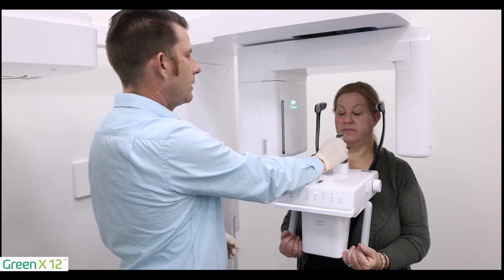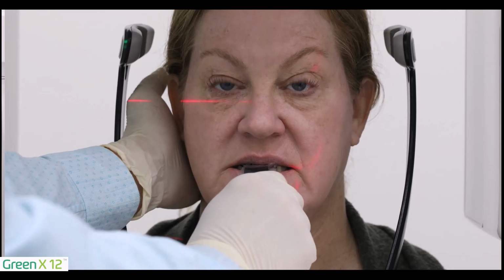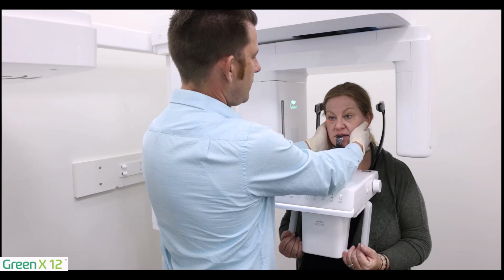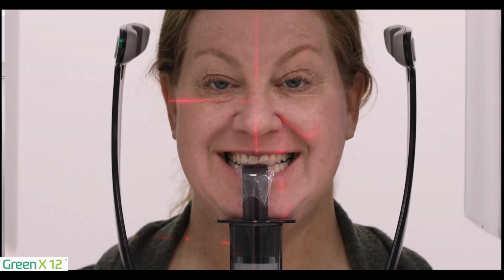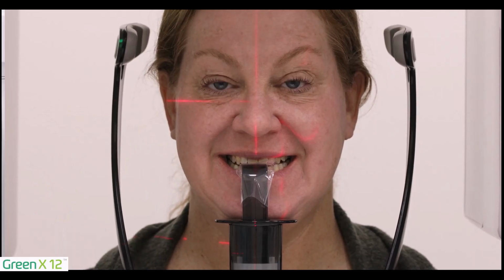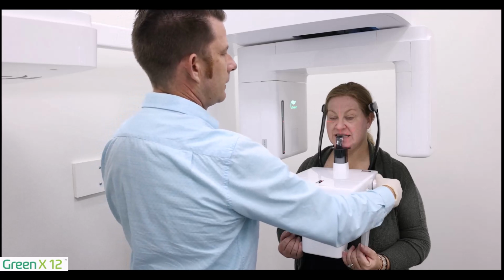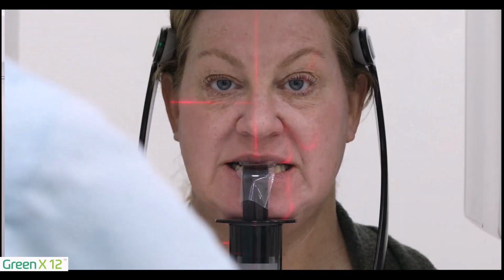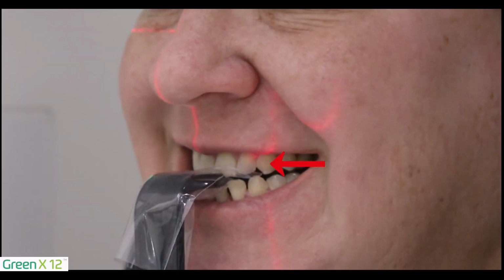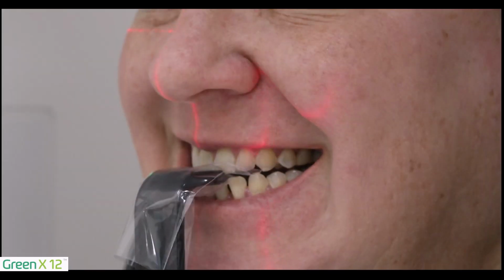I'm going to have you go ahead and open and bite on the bite stick. I'm going to ensure that the patient's chin is firm on the chin rest. Next, we are going to line the patient up center. Smile really big for me. We're ensuring the occlusion is tipped down about 10 degrees, or that natural head position. Next, I'm going to go ahead and close my temple supports and line the canine beam just mesial of the canine, or just in front of the canine, specifically for our bite wing feature. Smile really big again.